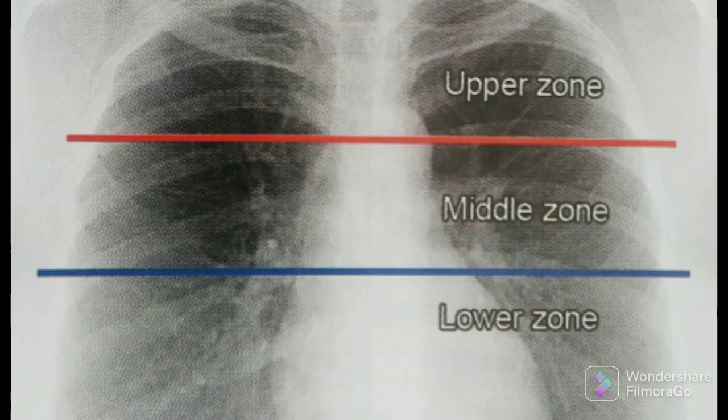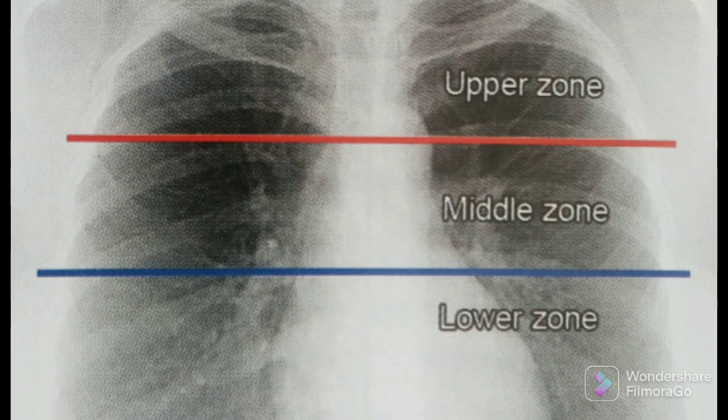Now we are talking about the zones of the lung. We have two lines drawn here: the red line passes through the anterior inferior end touching both second ribs, and the blue line passes through the same but at the fourth rib. The area between the red and blue line is the middle zone; above the red line is the upper zone; and below the blue line is the lower zone. Note that these zones do not correspond to the lung segments.